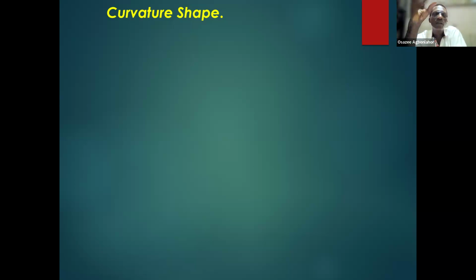So the point I'm making is, if that fibrous area, which is the stroma bed, begins to thin out, anywhere that is thin will automatically bulge, because of the pressure already within the eye. If the stroma bed thins out slightly, the pressure within the eye will push that area out.